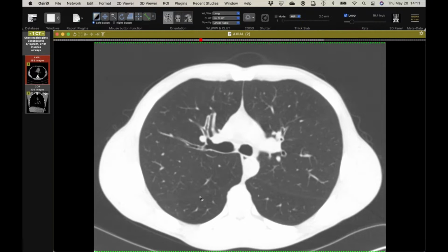Yeah, I agree. And he's got very nice bronchial wall thickening there. So he's got central and peripheral tree and bud, small airways disease. So large and small airways disease. Mm-hmm. Nice thickening. And I think aspergillosis is always there, and in this population it takes hold to varying degrees. You don't have to have the florid central bronchiectasis and large mucus plugs. You can have smaller airways involvement.